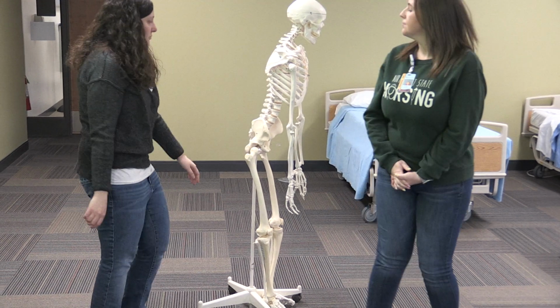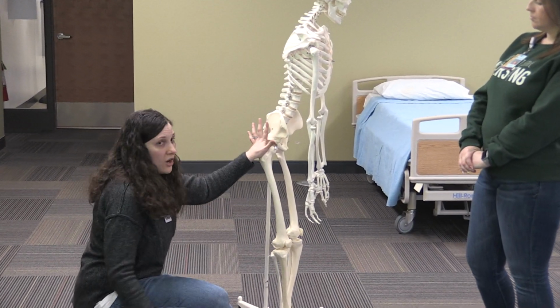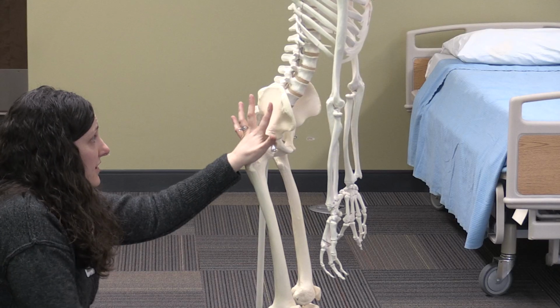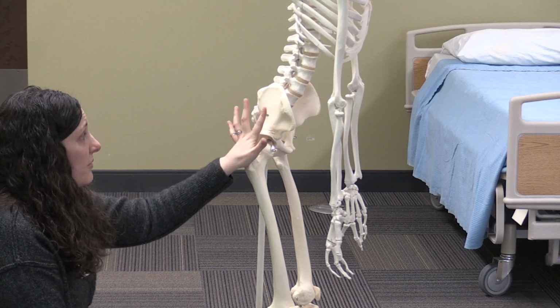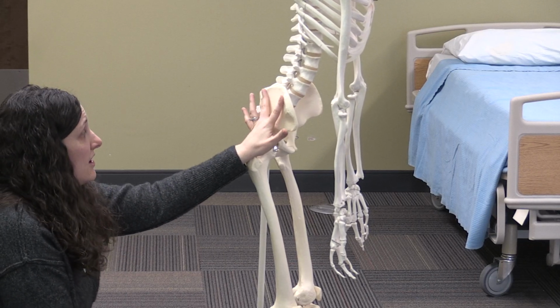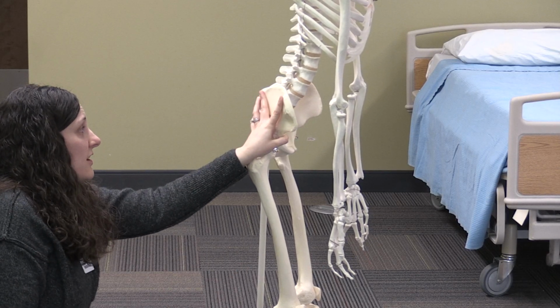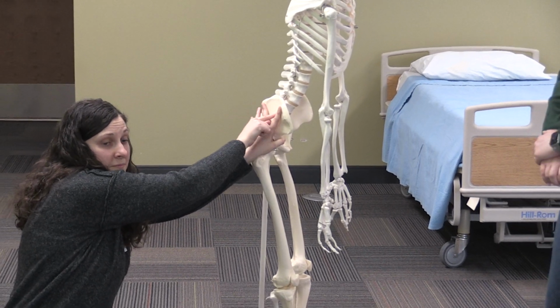So then, moving to Mr. Bones for this one, again, we're going to palm your greater trochanter. Your thumb is pointing towards your patient's umbilicus. Your index finger, as you can see on him, I'm needing to move my hand up off the greater trochanter to have my finger on the anterior superior iliac spine and my middle finger on the posterior superior iliac crest, and I'm injecting between them.